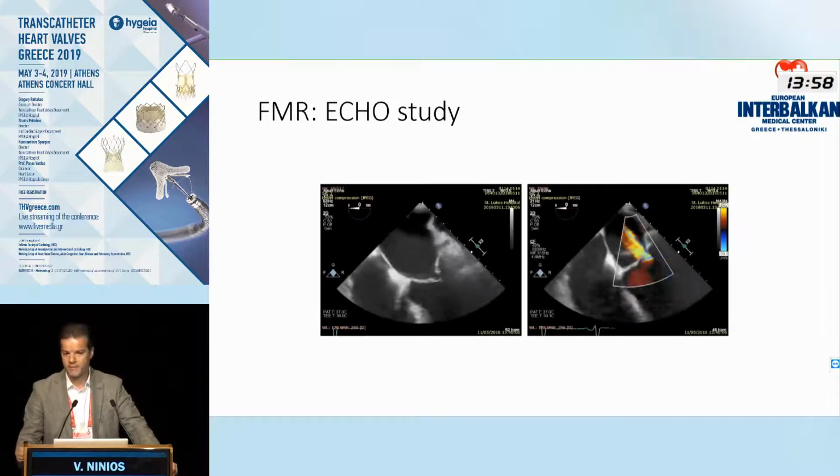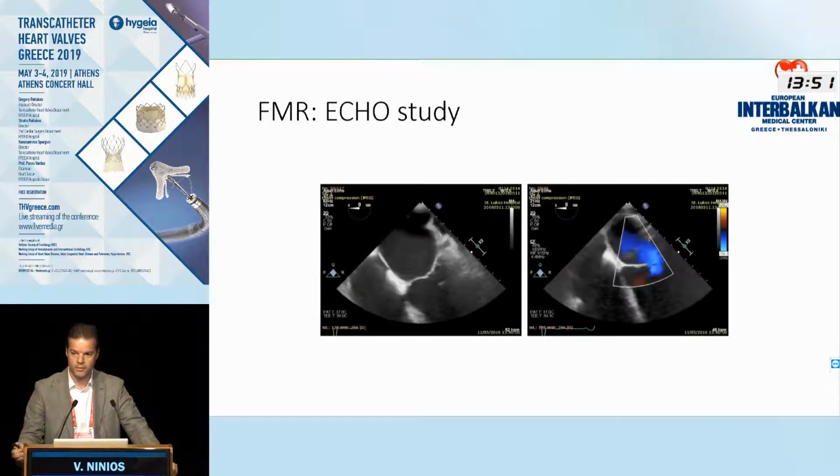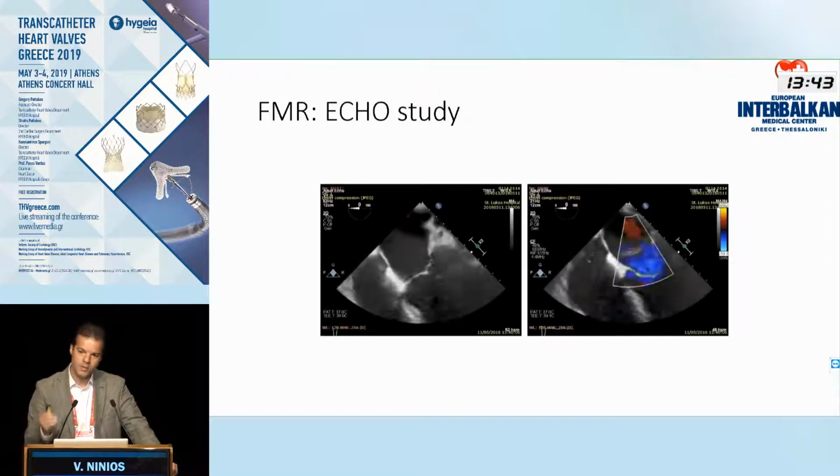Now, 0 MR is a very ambitious target. We know from the surgical era, especially from functional mitral regurgitation, that 0 MR is a holy grail, you cannot get it. But surely if you aim for a 0 MR, you may get a better result. And now this is when the number of clips has started to go up.